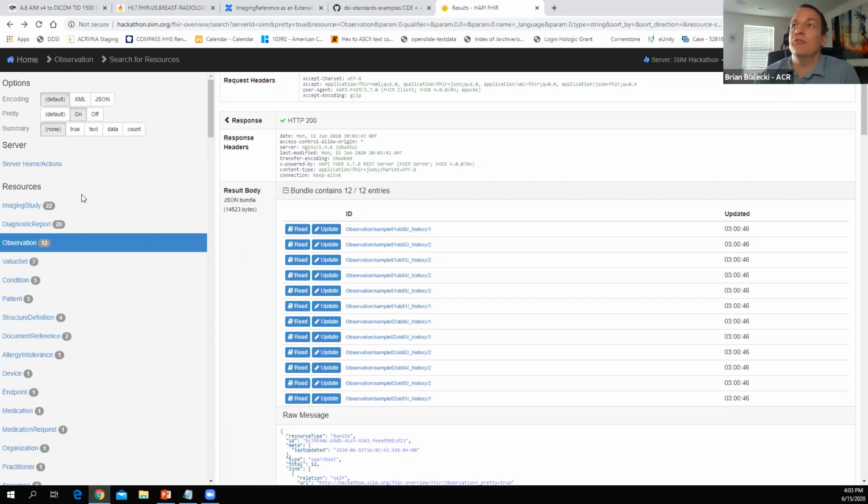In surgery, I've called that image directly using RESTful services and overlaid that particular arrow. We know exactly what we were talking about.